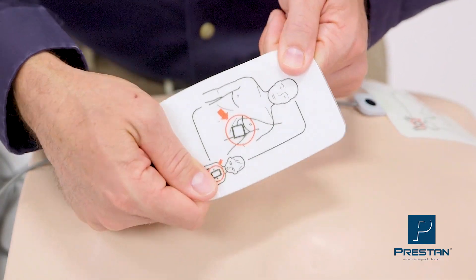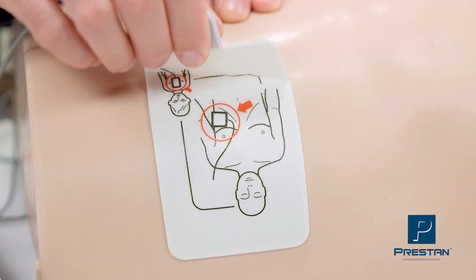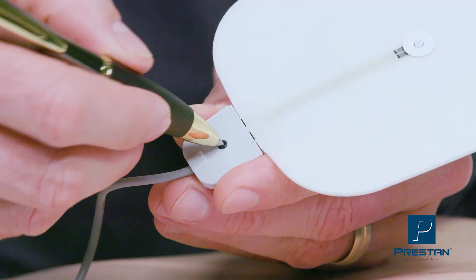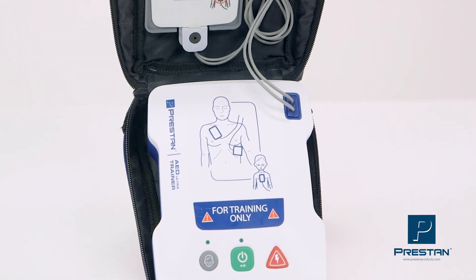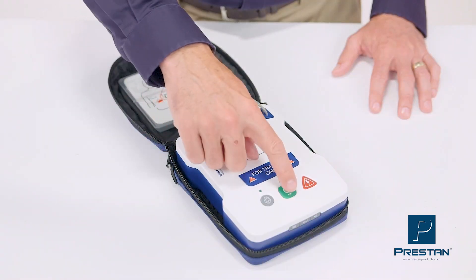The pads are durable, lasting up to 100 applications, and do not leave behind that annoying sticky residue. Replacement is easy and affordable.